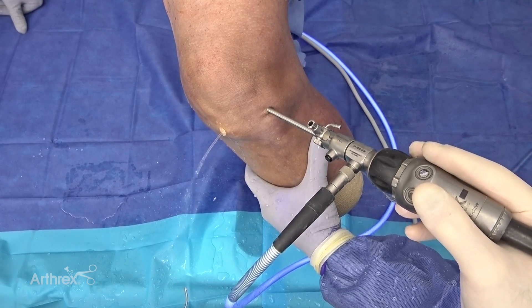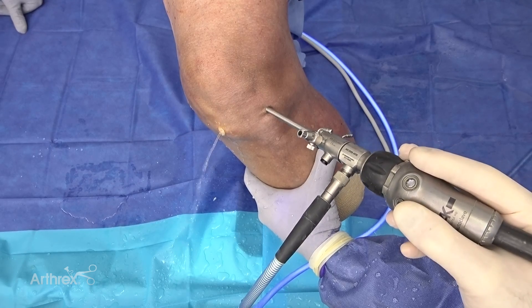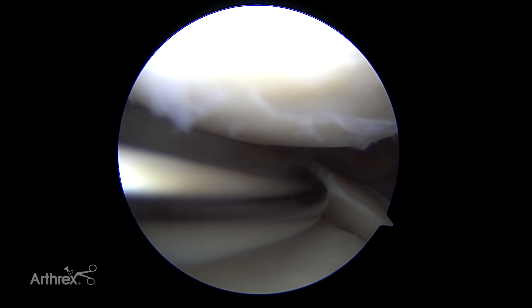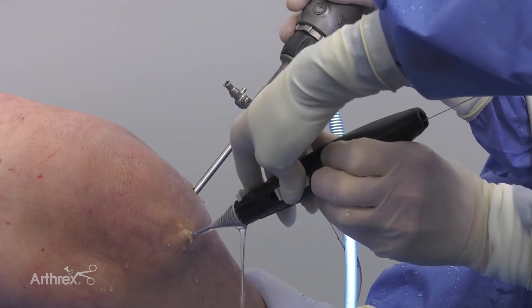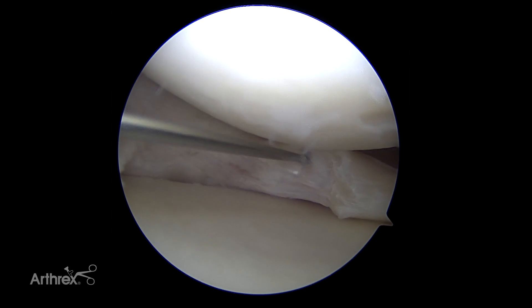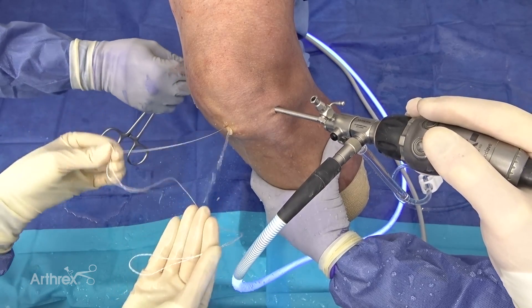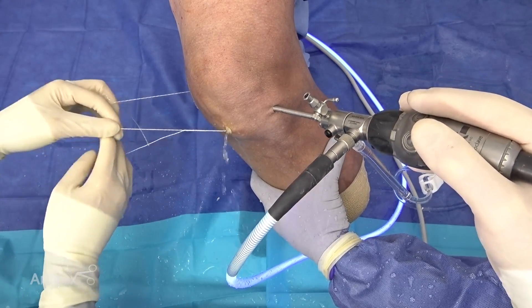We're going to use our zone navigator and pass four sutures in the native remaining meniscal rim. That is how we will pull the segmental meniscus into the joint, attach it, and suture it to the capsule. We have the zone navigator and we're going to pass first the posterior superior suture. Here's our needle loaded, passing through the native rim of meniscus, retrieving that needle percutaneously on the posteromedial side. Now we're going to pass a shuttle suture — a tiger link. We'll pass the free end, and the loop part of the link will allow us to pull the meniscal sutures in for the actual segmental transplant. That's our first suture.